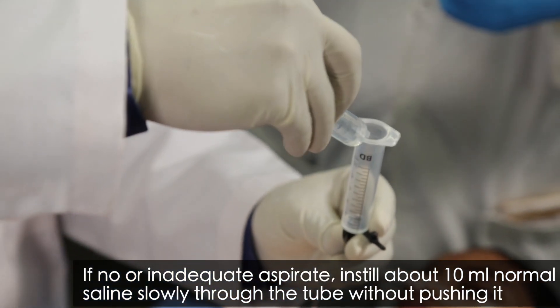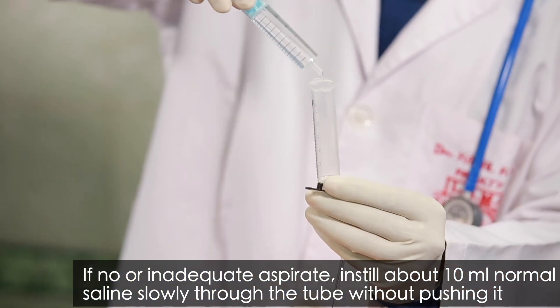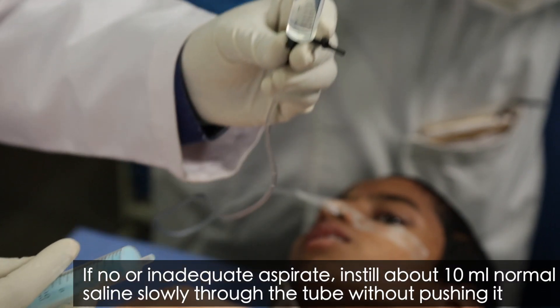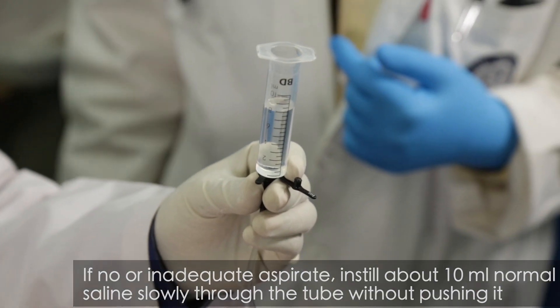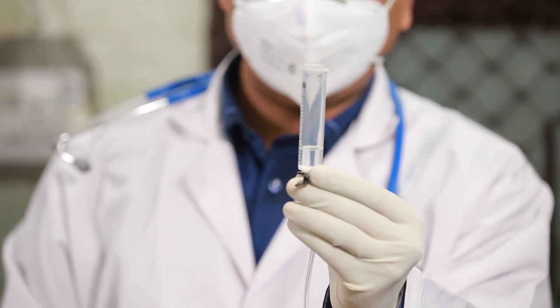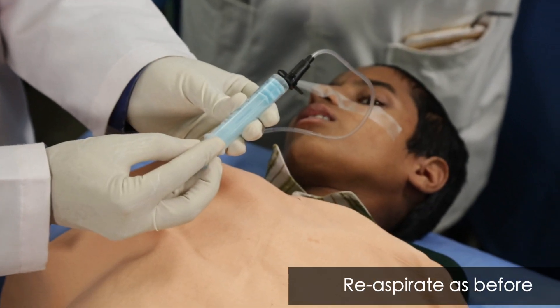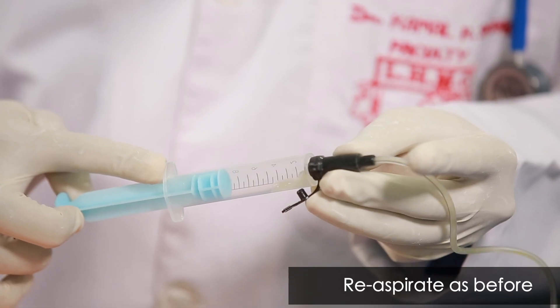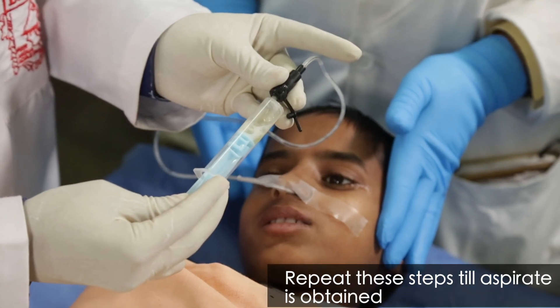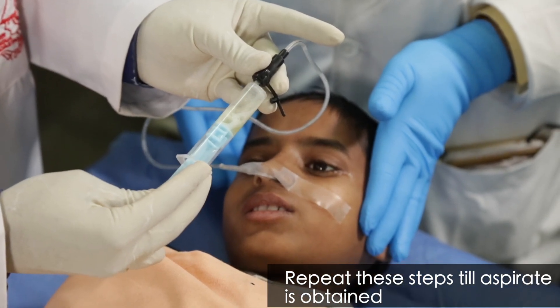In case direct aspiration fails to provide adequate specimen, instill about 10 ml of normal saline through the tube slowly and allow it to gravitate on its own. After instilling, re-aspirate while rotating the patient through supine as well as left and right lateral positions. Repeat these steps until gastric aspirate is obtained.